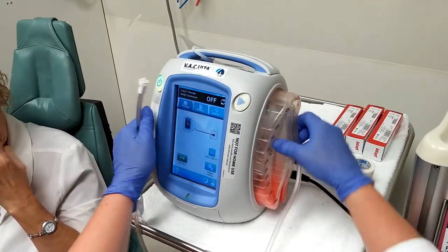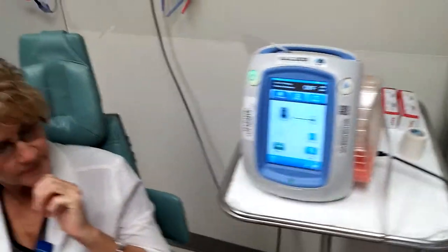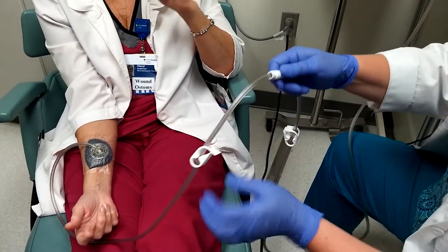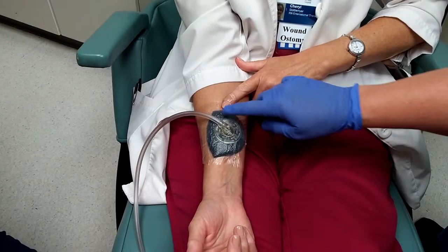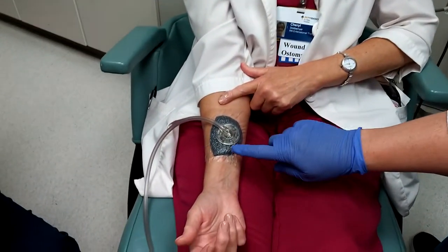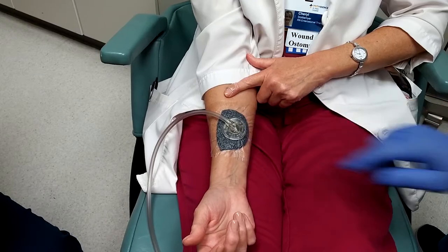It'll fit snugly so it doesn't come out. Then reconnect and unclamp, and you'll notice it's kind of ballooning back out now — that's what you don't want it to look like. So we turn the suction back on; tell them it's going to suck down because that kind of hurts a little bit. And it goes back to looking like a raisin.